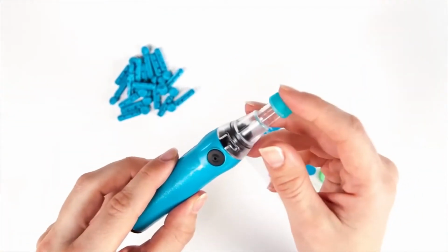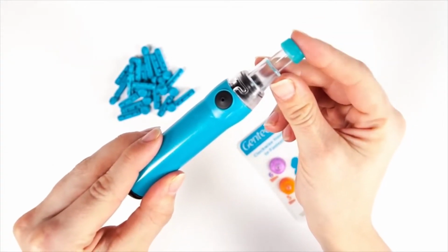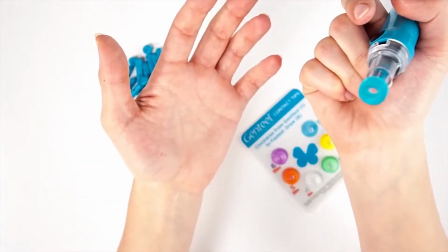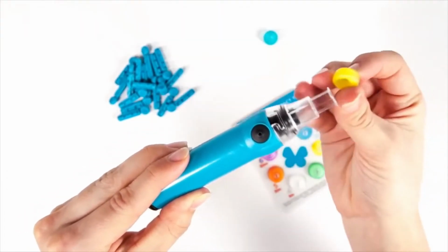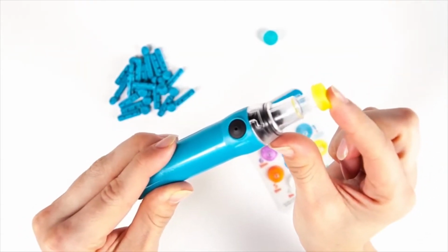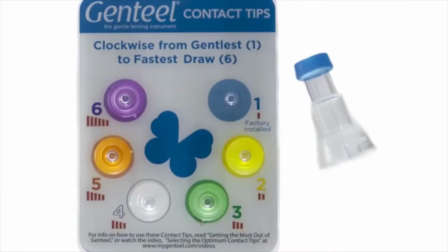If this is your first time using Genteel, keep the blue contact tip on the nozzle and proceed. If you have previously used the blue contact tip but have not yet retrieved the amount of blood you need, remove the blue contact tip and replace with the yellow contact tip. Make sure it is secured on the nozzle without any air leaks. Finish the remaining steps of these instructions until you get a sufficient amount of blood. You may need a few attempts to discover the correct contact tip.